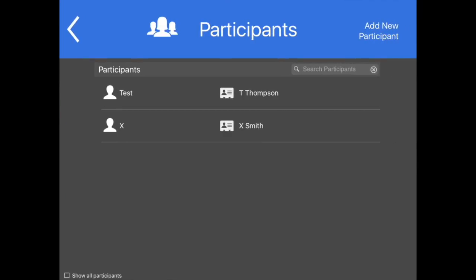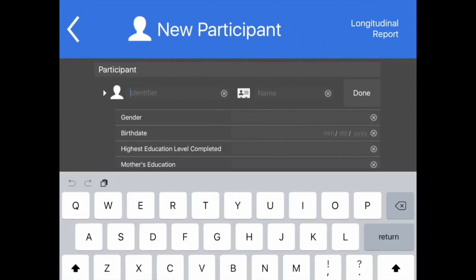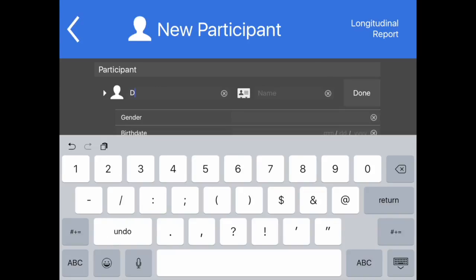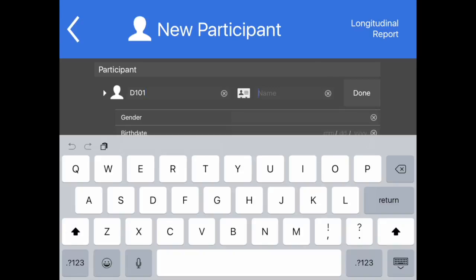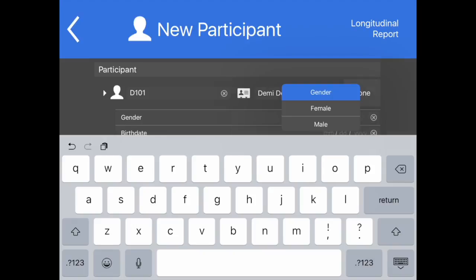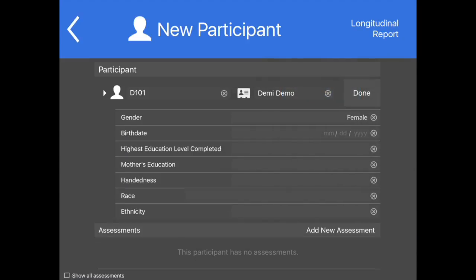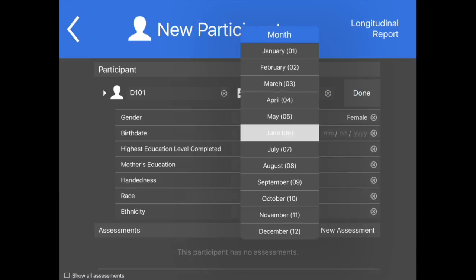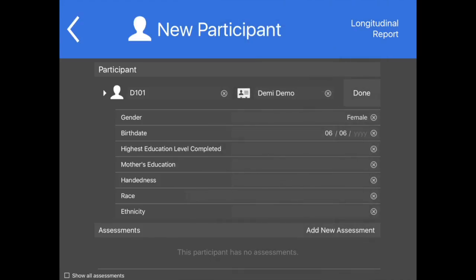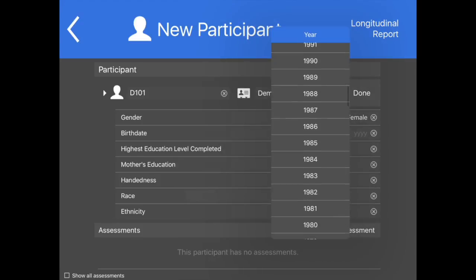To create a new participant, tap Add New Participant in the upper right-hand corner of the participant screen. This can be done either before the session or on the fly. Complete the new participant information. Please note that some of these fields may be required for some instruments. Examiners will be alerted when launching an assessment if one or more required fields are missing based on the selection of instruments.